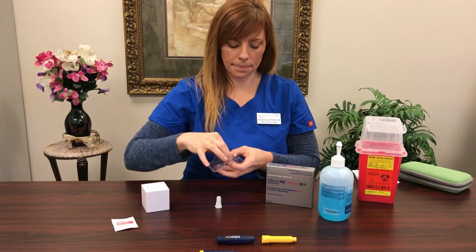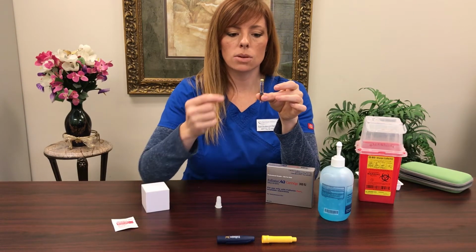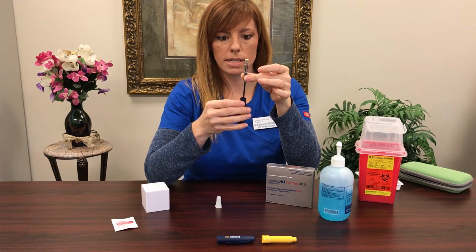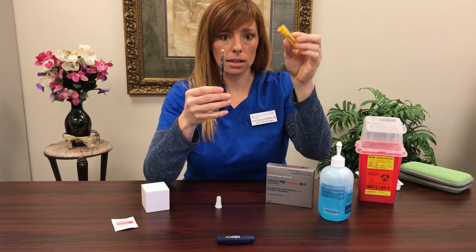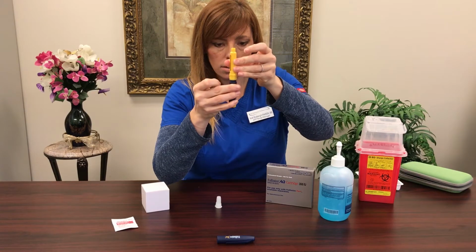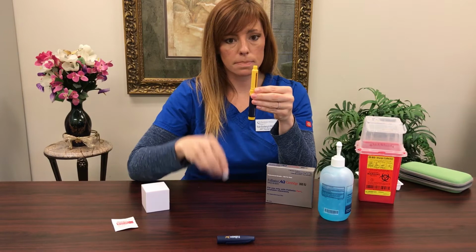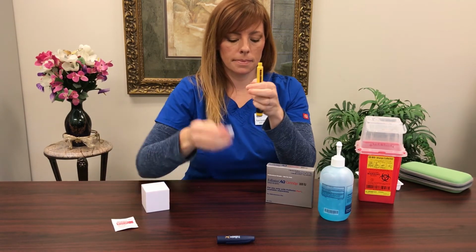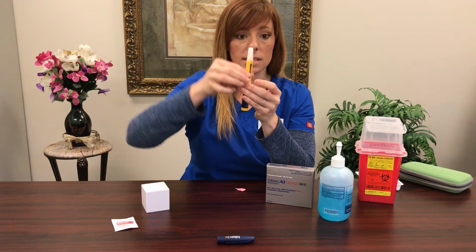Open that up. We're going to load our pen. All you have to do is load it. When you have your cartridge sitting upright, the metal is towards the ceiling. I want you to just drop it down over top of the end of this black portion in the pen. You're going to take the yellow cap of the pen that we unscrewed, place it on top. We're going to push down. Then you're going to screw that back on. Okay? The next thing I want you to do is peel the paper top off of your needle for today. And you're going to screw that on top of your pen. Just like so. Set this aside.